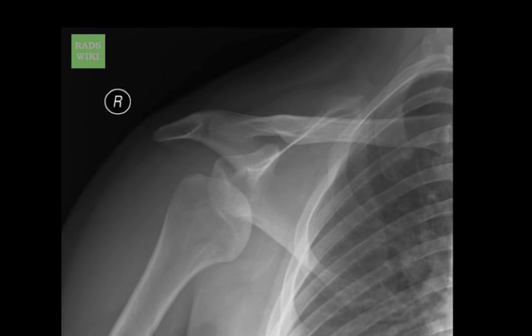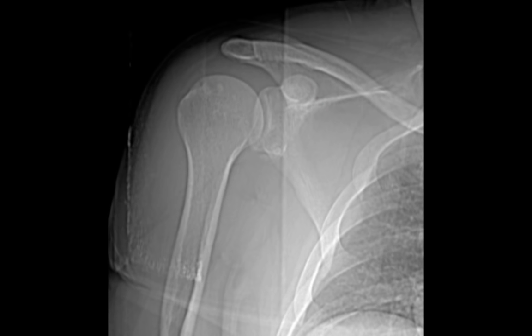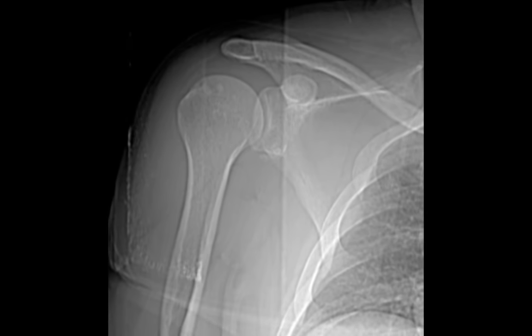What's the abnormality of this shoulder x-ray? Once again, the humeral head is outside of the glenoid fossa and below the coracoid process. This is an anterior dislocation. Here's a shoulder that was dislocated and is now reduced — is there any bony lesion you can see? If you look carefully at the glenoid fossa, there is a bony fragment that's come off. So we've got a Bankart lesion, and we can confirm that with a CT scan.